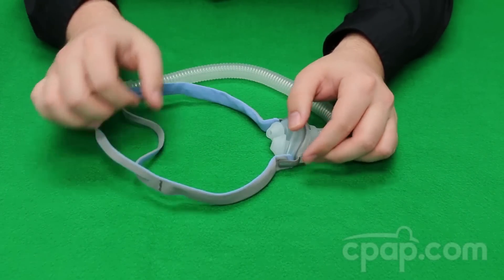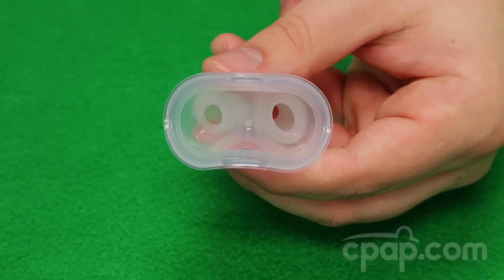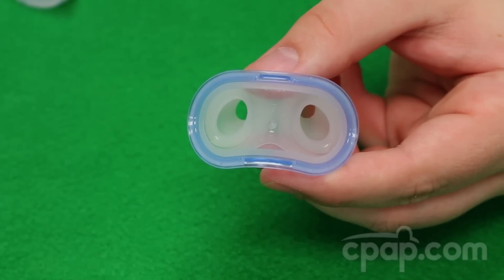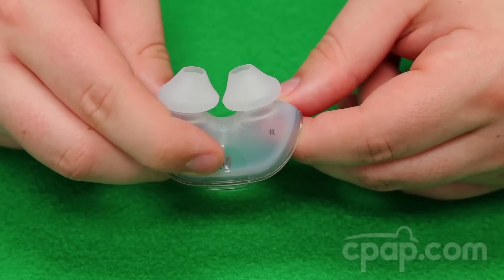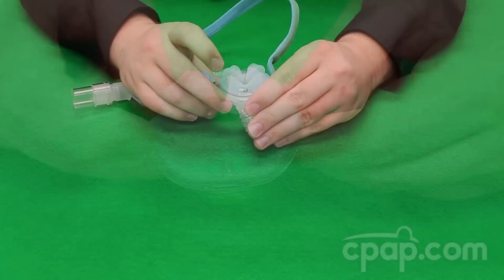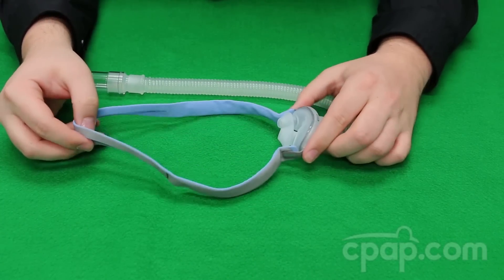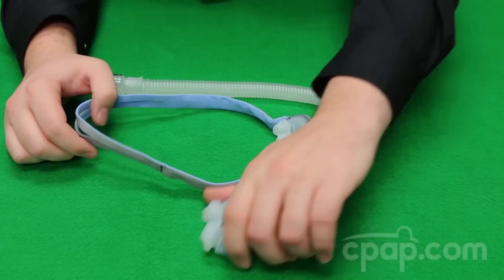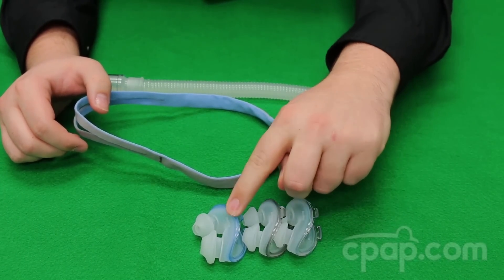The pillows are color-coded: extra small is pink, small is clear, medium is gray, and large is blue. There is also a size indicator on the bottom of the pillow itself to identify the size, as well as left and right indicators to properly orient the pillow on the mask. The standard AirFit P10 comes with three sizes of nasal pillows: small clear, medium gray, and large blue.